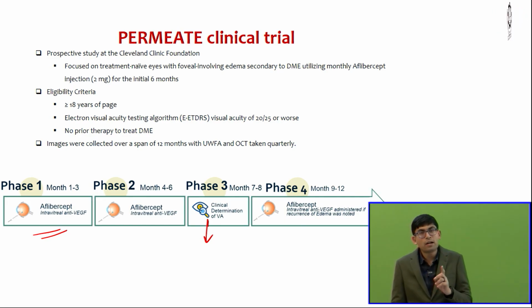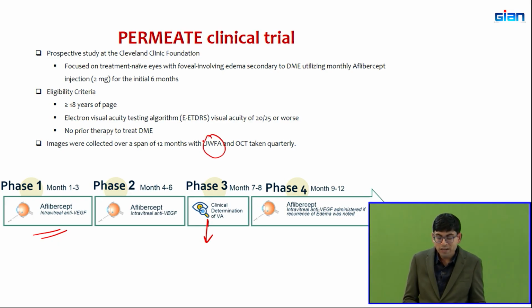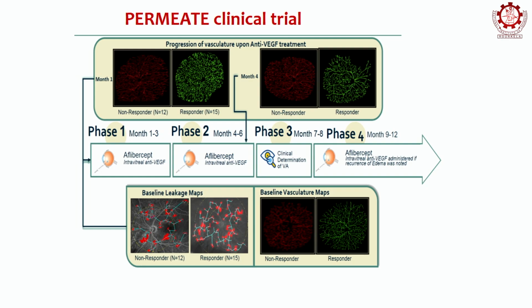The modality that we used here is called UWFA, ultra wide field fluorescent angiography. So, this is a modality that helps you look at the morphology of the blood vessels. So, here is what it looks like.